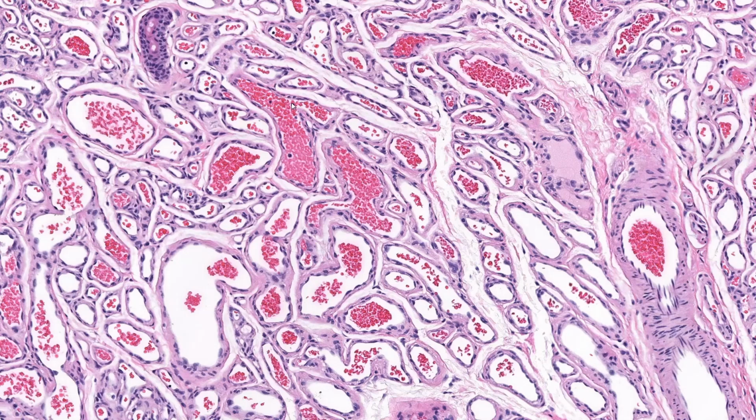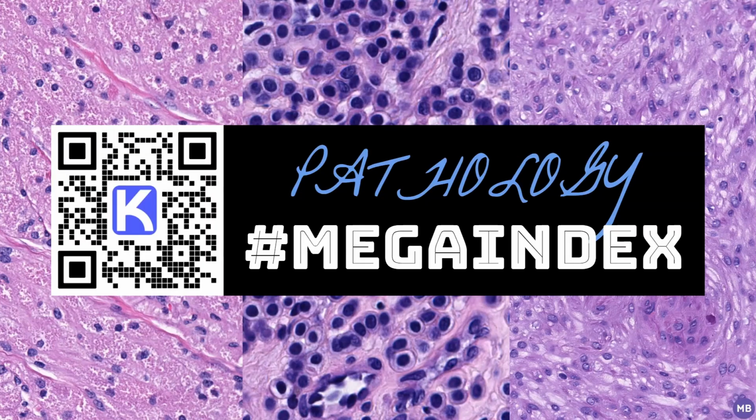One pitfall to be aware of is that red blood cells are also positive for GLUT1, so it is important to take a closer look to confirm that the staining you see is actually in the endothelial cells and not in red blood cells stuck to the vessel wall. And that's all I have for now.